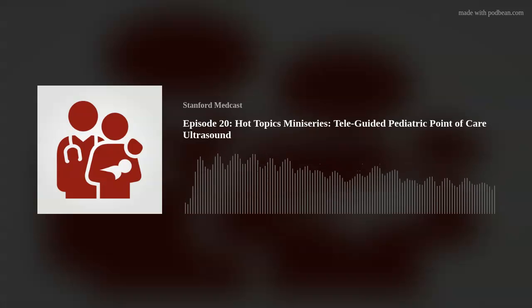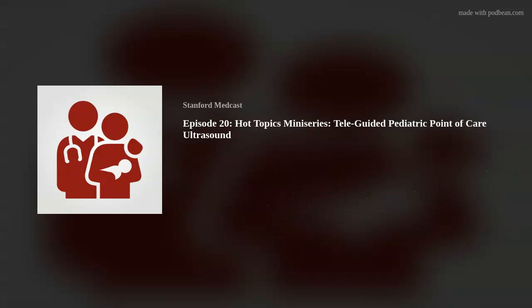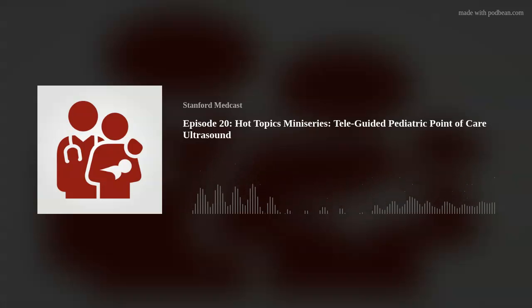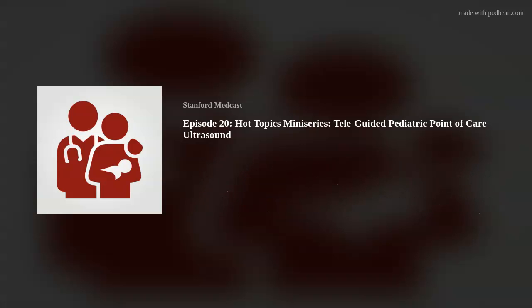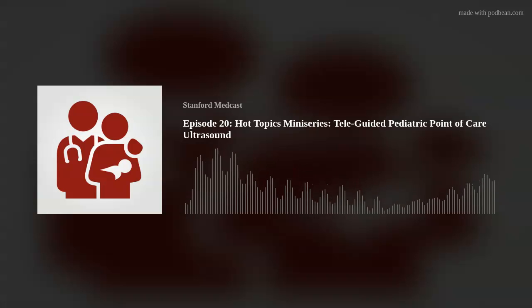And I think that's what a lot of people are finding very interesting and very appealing, physicians who want to help. It sounds like the benefits of tele-ultrasound are accessibility and being able to communicate with clinicians that may not be at some specialty centers or high-level institutions. Is that correct? That is correct. I will mention one caveat. I'll take it one step further: the operator of the ultrasound while being guided doesn't even have to be a clinician.